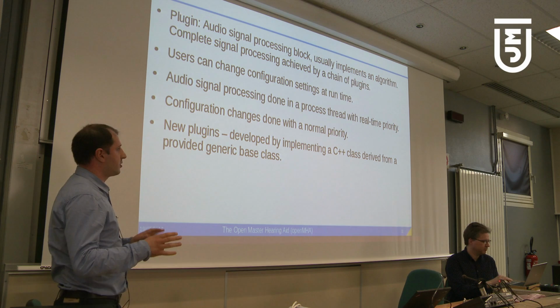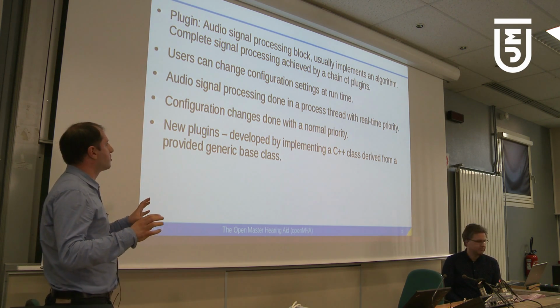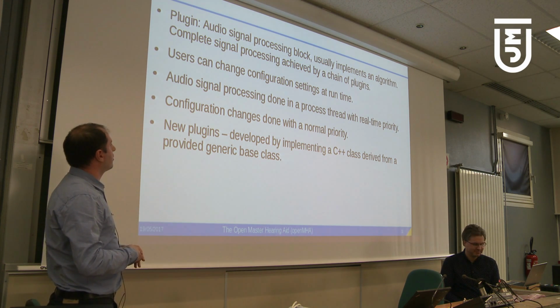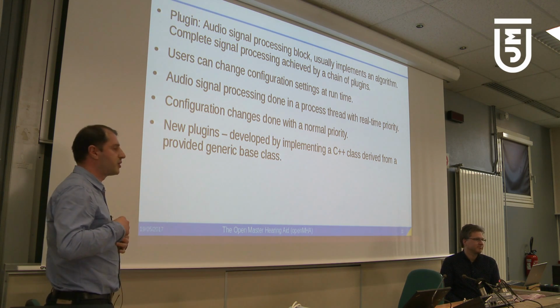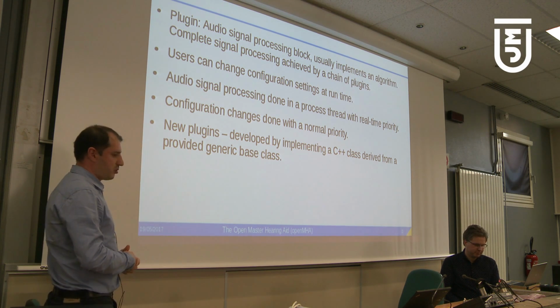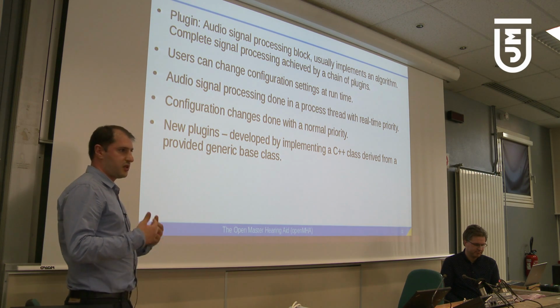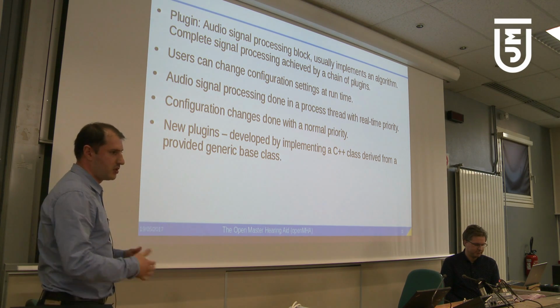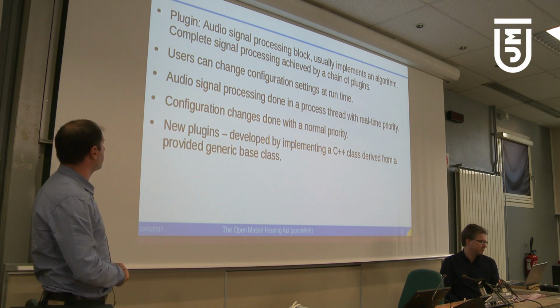Before going into details of the software itself and the usability philosophy that we envisage, I wanted to mention first the main building block from the developer side, where they can contribute, which is, similar to other platforms, I guess, a plugin, which usually implements a signal processing algorithm, which then can be included in some bigger chain of these modules to achieve a certain method of signal processing.